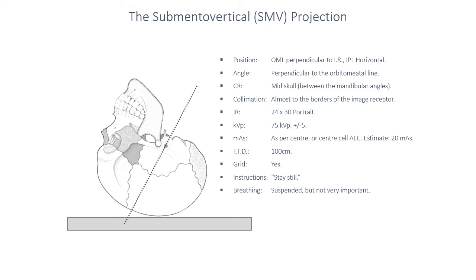We start off with the patient in a seated position. They are shaped like a capital L, if you like. You're then going to place 3 of the fluffiest pillows you can find in the department against the patient's lower back. You're going to then encourage the patient to hyperextend and bend over those pillows, and then to tilt their chin further back so that their head is essentially completely upside down. The vertex of the head will be in contact with the image receptor or the supine bucky.